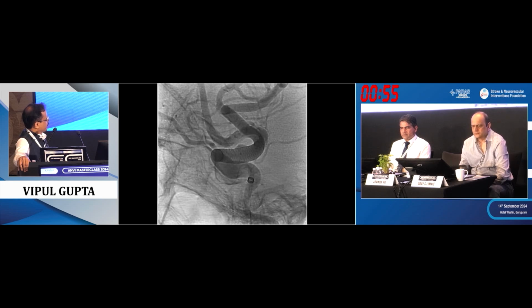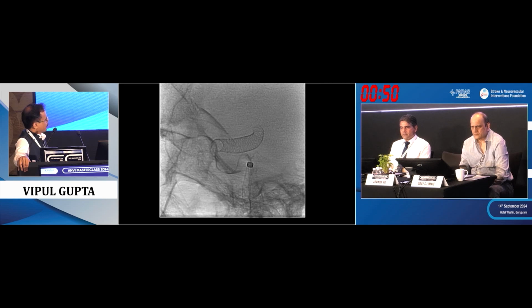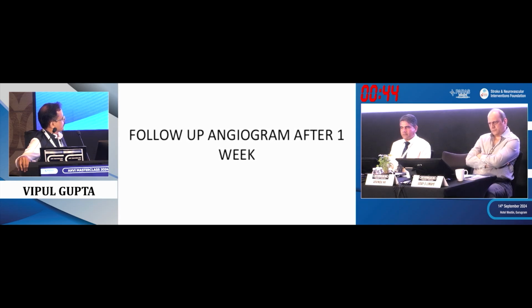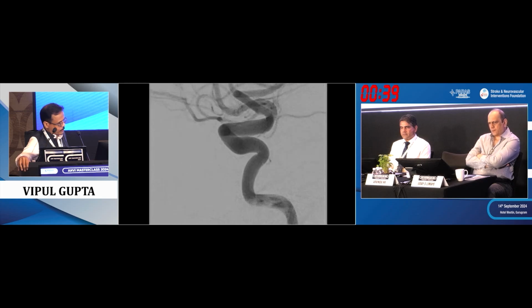Again, you can see a slightly overexpanded but very compressed flow diverter in the region of the blister aneurysm. And what we realize in most of these cases, one single device is enough. This is a Vaso-CT, not a great image. For vasospasm, we had to do an angiogram after a week. We don't usually do an early angiogram, and the aneurysm was all gone.